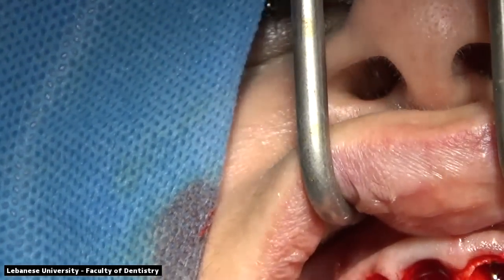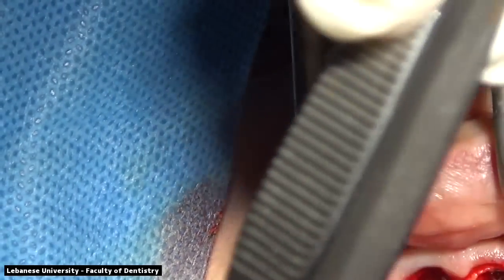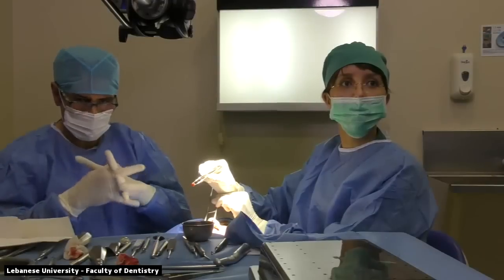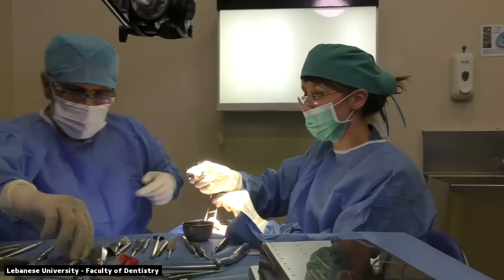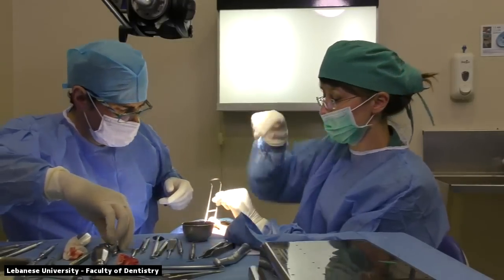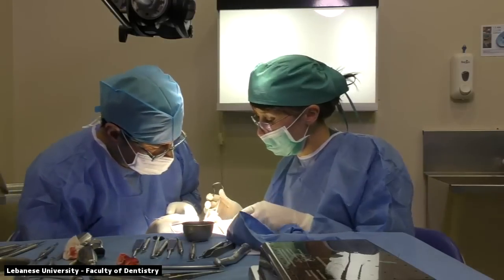So this is the right central incisor, and we can see that the whole root is intact and the tip is present, so there is nothing remaining inside the socket. The whole root has been removed. And we can also see that there is only the root that's present. The crown is almost gone because of the fracture, and the other central incisor is also completely intact.